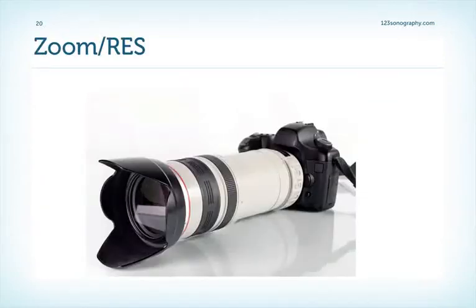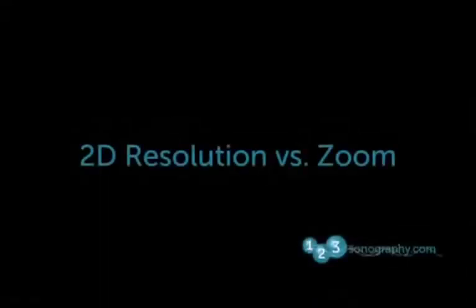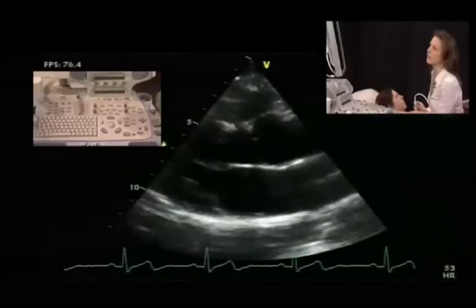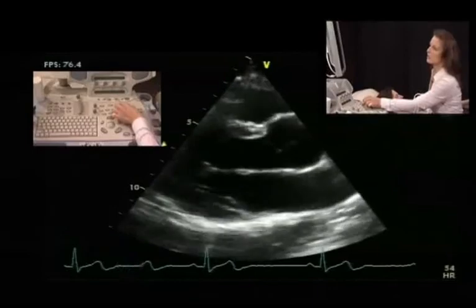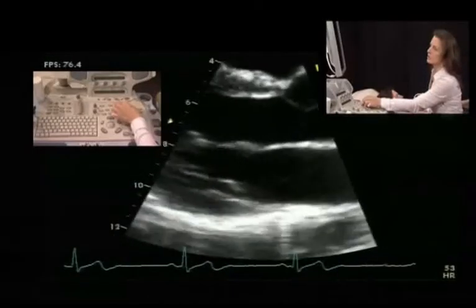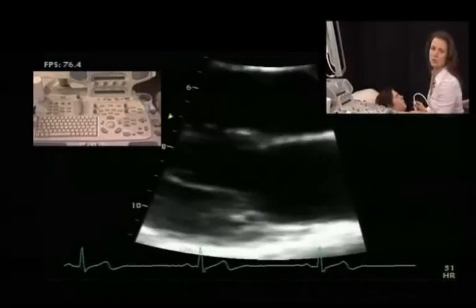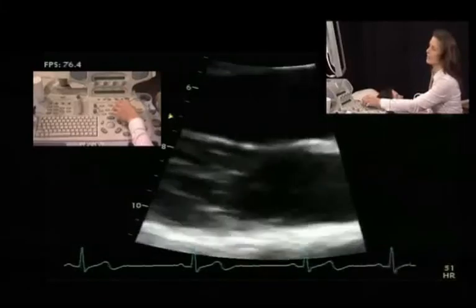I already mentioned that the ultrasound machine is not much different than a camera. In both we have a focus, and in both we also have the potential to enlarge the image. In ultrasound we call that the zoom or res function. So we are talking now a little bit about the zoom functions. It might be interesting, for example, for the valves to get a bigger image and to zoom in on it. So you have a nice rotational knob, which you just rotate to adjust the image size you want to have. Don't make it too small, you should still see the whole valve for example.